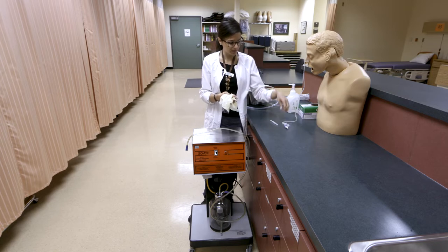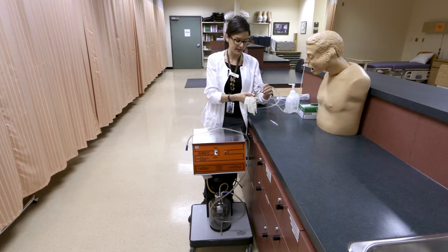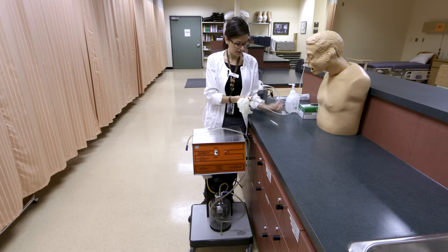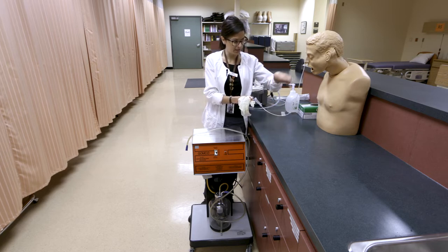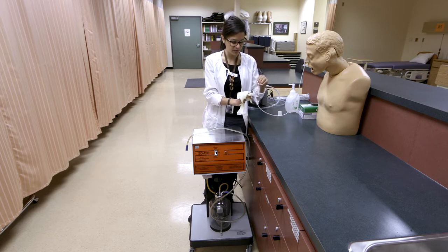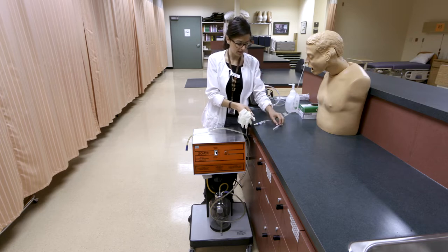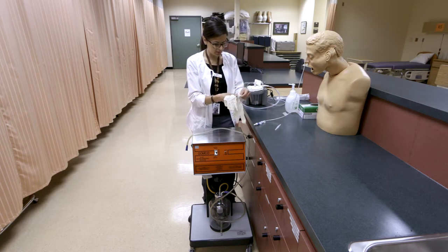We've confirmed placement of our tube — we're not going to be instilling anything into it right now. When we put in this Salem sump, it came with a connector piece. For decompression, you'd actually want to keep that connector piece in the port.